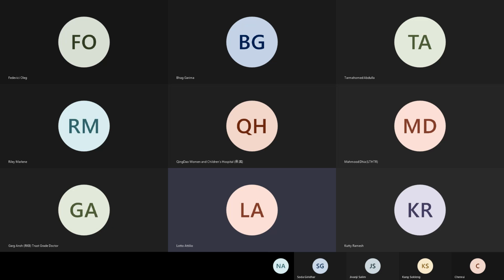In these cases, for subsequent surgery, we have also started a program of Melody valve implantation. We have done one in a complete AVSD after 2 repairs, and it has gone well. So it's something we now keep on the shelf, because in these cases it's quite unpredictable how the valve will behave after surgery. Knowing that you have a way out with a biological valve modified in such a technique that guarantees a competent valve is important.